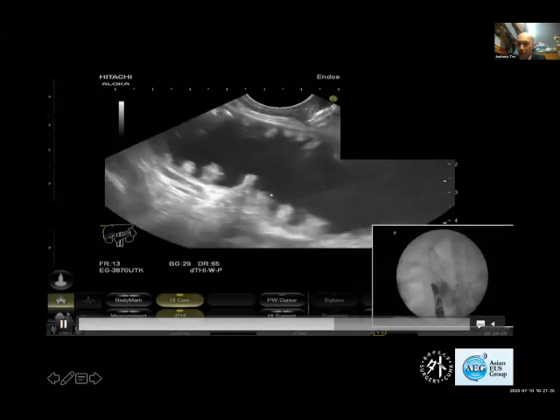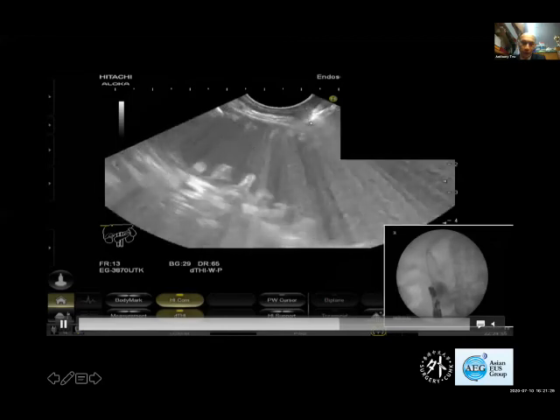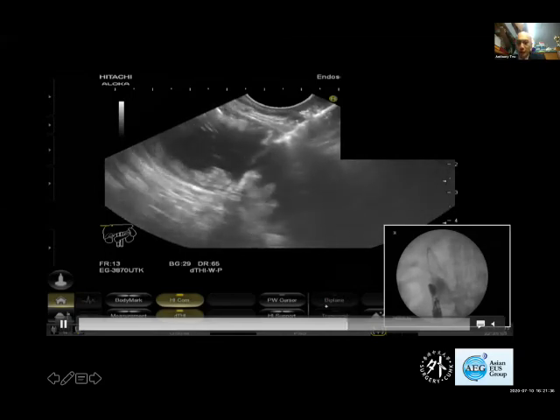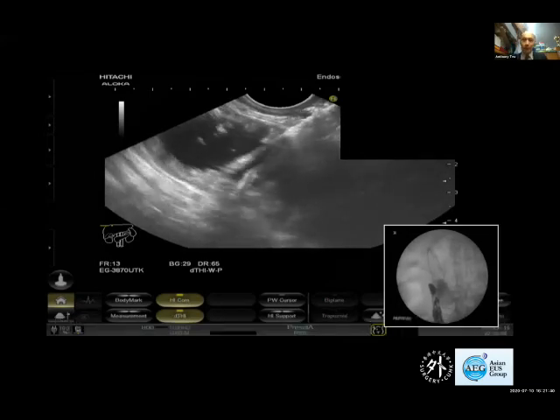It's kind of like a drainage of a pseudocyst or a gallbladder. So you can just go in direct puncture, burn the way through, go inside, and then deploy the Axios. And the gastroduodenostomy would be finished in 5 minutes.